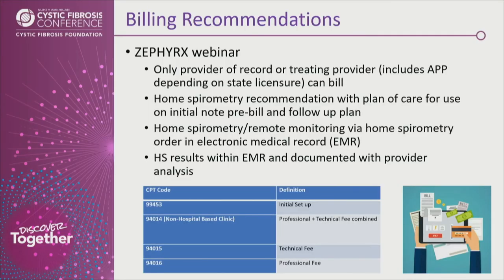So billing. As many of us mentioned already, we did attend a Zephyr Rx Medicare consultant webinar on billing, and this happened in 2020. And really, she gave really good specific information, one of which was that it really could only be billed by the provider of record or treating provider. And APPs are included, but this depends on your state.